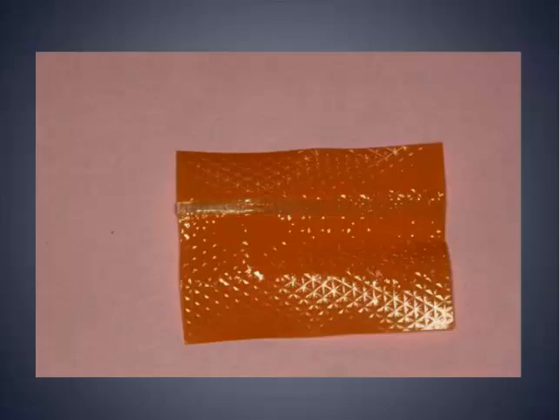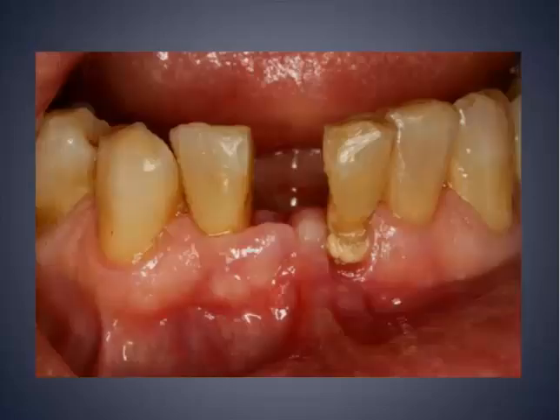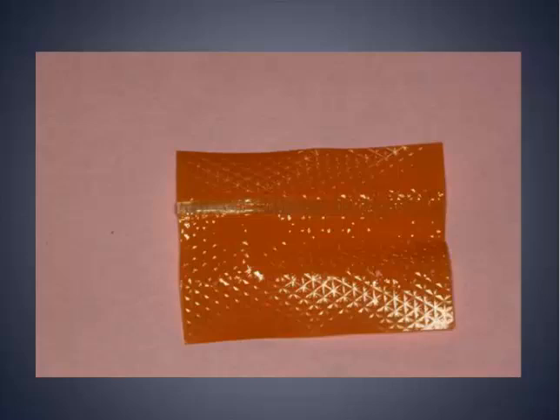Here's how it comes — we opened it up. Here is that foil packaging. You can see the light strand within the orange packaging. What I do is measure internally approximately how long a strand of Grand Tech I'm going to want. Then I fold the orange packaging over, and using a piece of dental floss or a ruler as a guide, I overlay that and cut through the orange material and the Grand Tech fiber inside. I would save the other piece for future use and use only the piece that I need.